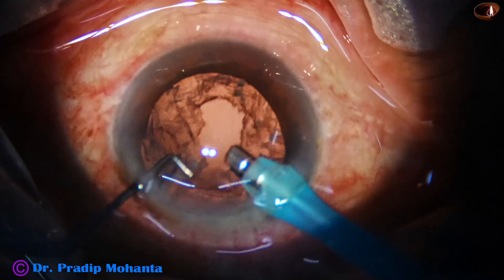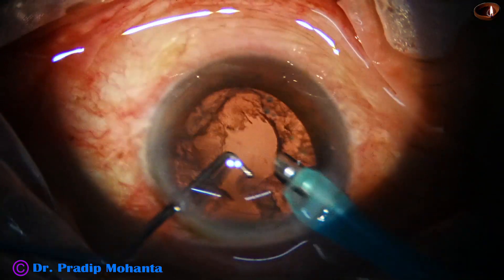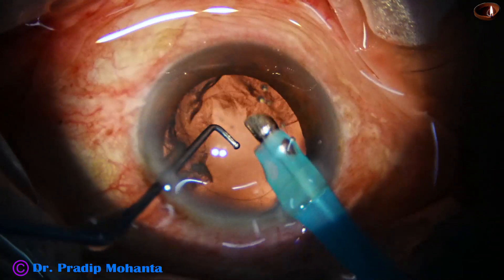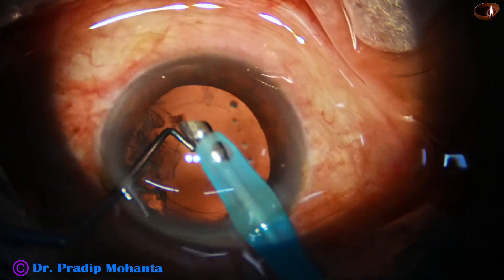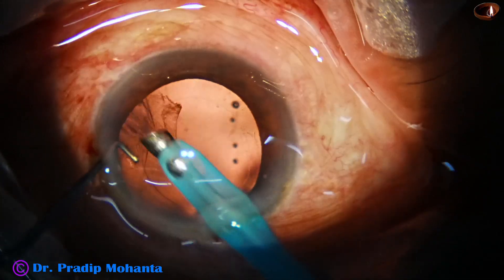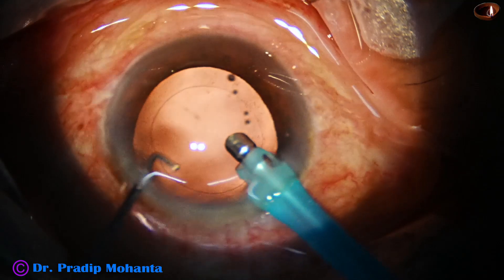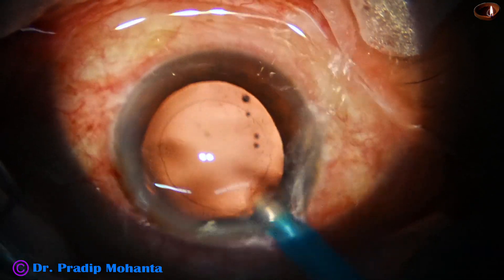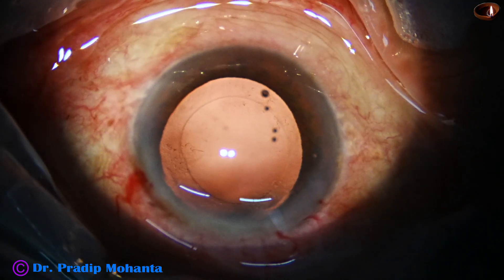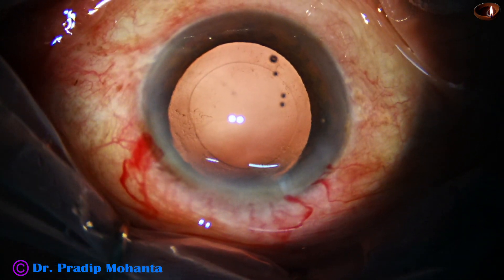This is a totally unedited, real-time surgery. You now see cleaning of the cortex by the handpiece itself. There is some learning curve — you are going to rupture 2 to 3 posterior capsules when you learn this. You can protect the posterior capsule with the ball-tipped nucleus sustainer to some extent, but yes, you do have to go through a learning curve.